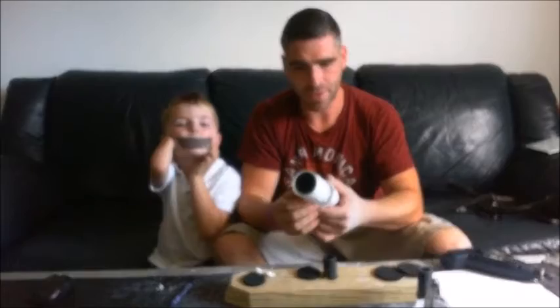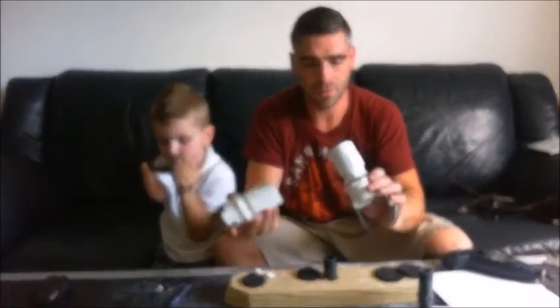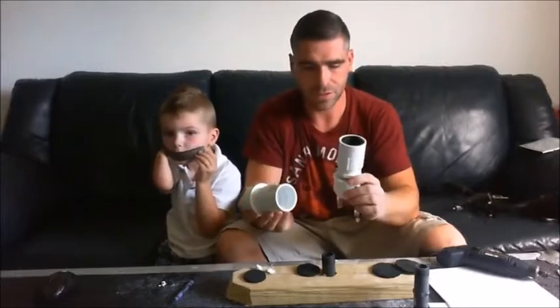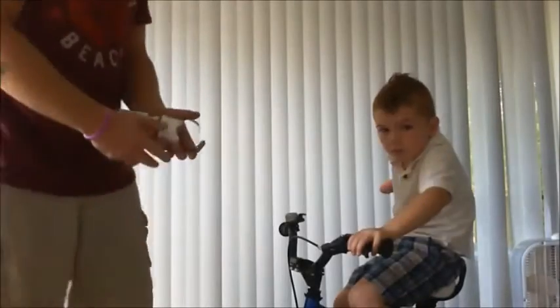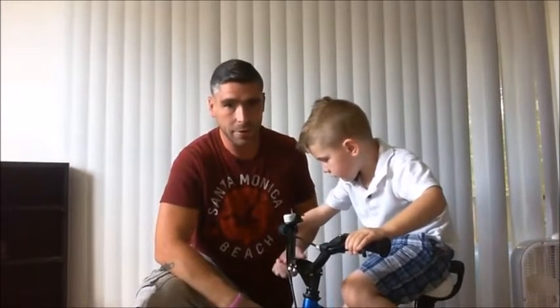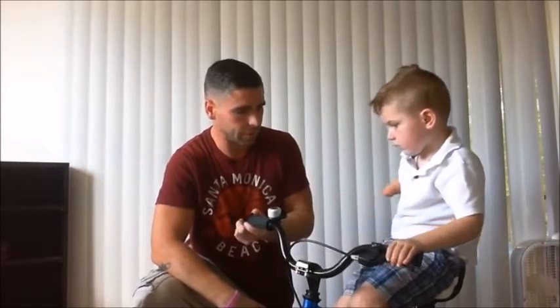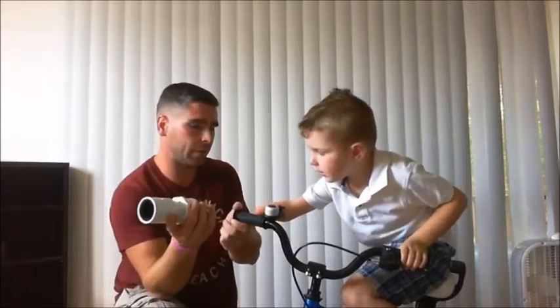This is the second one we've made — the first one has been working really well for Carter. We're going to put it on his bike and show you how it turned out. You can see on Carter on his bike — if he wants to turn this way at all he can't reach it when hunching over. So this is the solution we came up with.